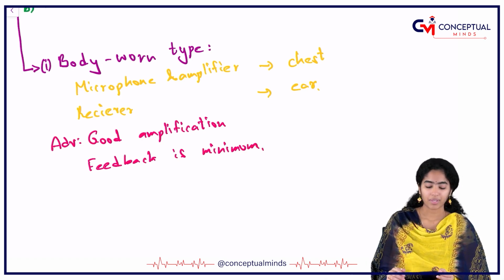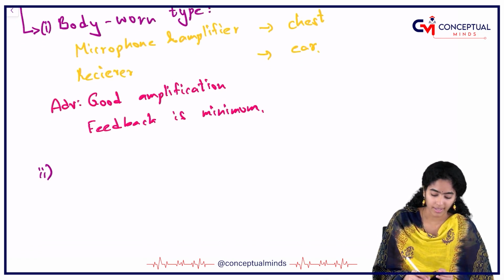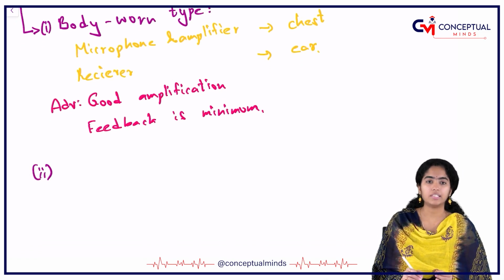Is this clear to you? Now let us move on to the next type after body-worn type, and that is behind the ear types.